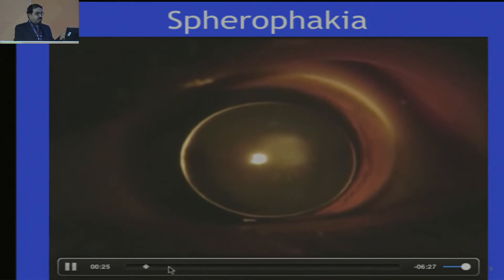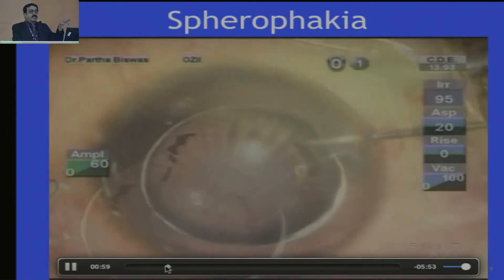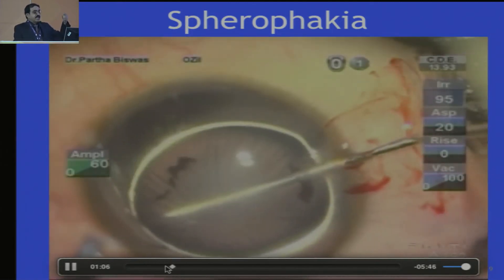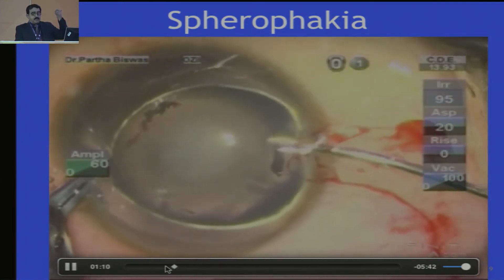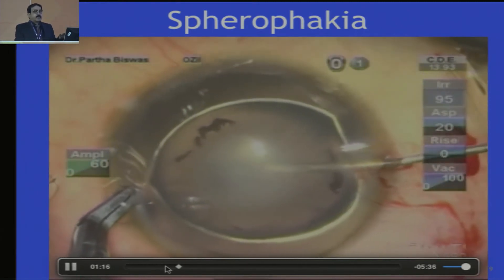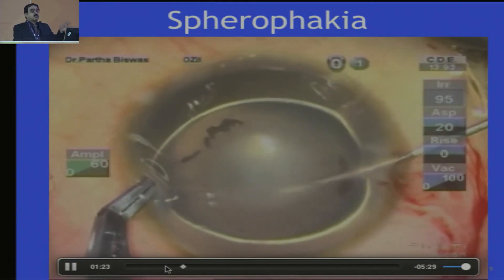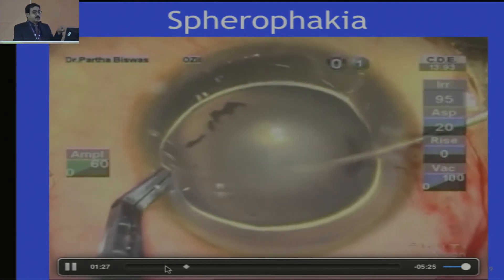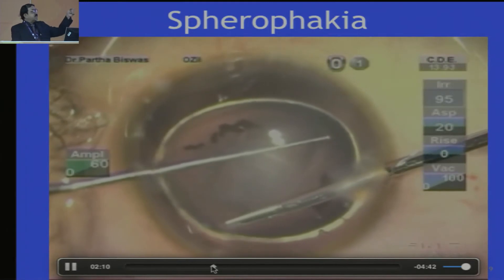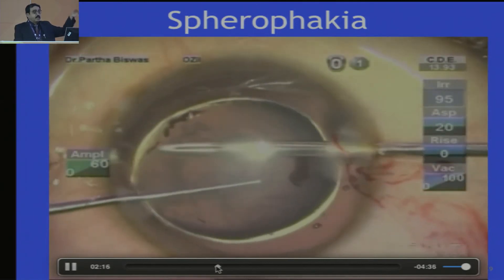This is a spherophakia case in which we did lens implantation. Do attempt spherophakic eyes — do attempt. In this one it was a specially difficult condition because the anterior capsule was adhered to the posterior cornea and that adherence was separated. We were expecting total white cornea and everything, but really not — the cornea was well maintained. Because of the fibrosis of the anterior capsule, capsulotomy was difficult. But again we could get a puncture and do the capsulotomy. You can see the ball dialer helping to do the capsulotomy and the excursion of the forceps going all around.